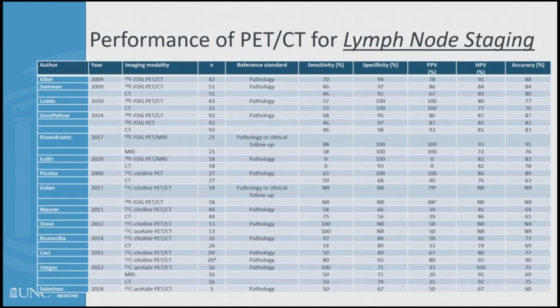Looking at lymph node staging across the literature, again, there's different imaging modalities, including FDG, as well as some choline agents. The pathology reference is pretty wide and heterogeneous. Typically, these studies have not been very large, and again, that's reflected in their wide sensitivity, specificity, and predictive values.